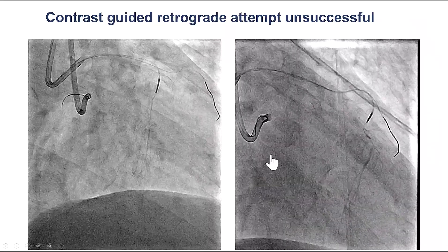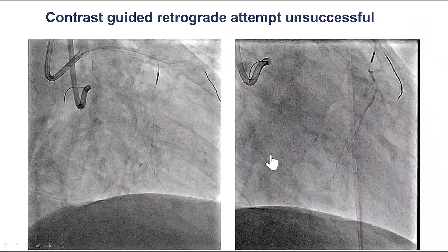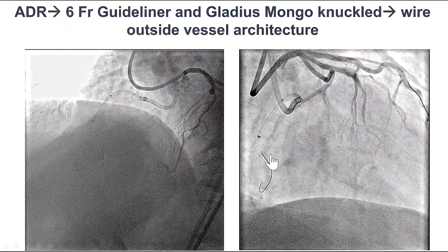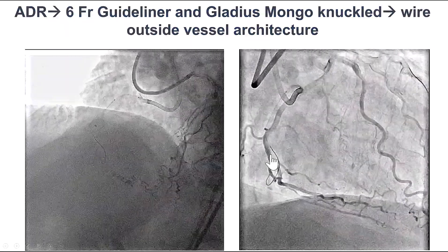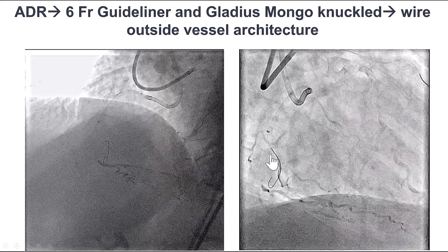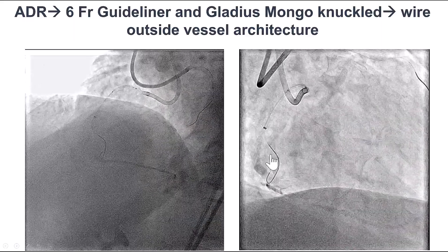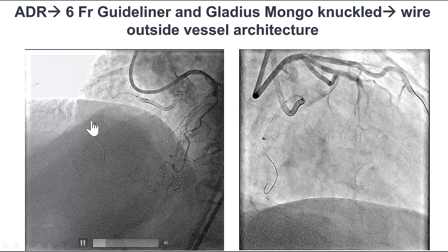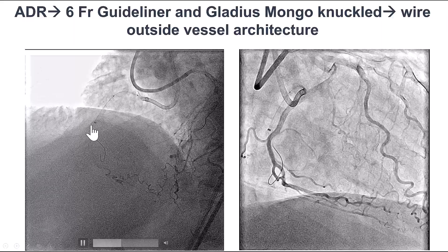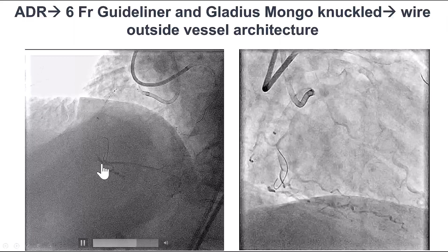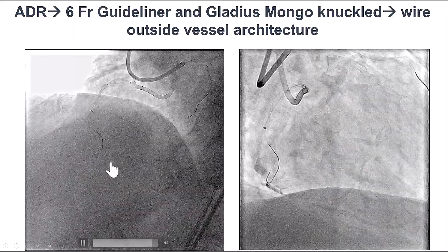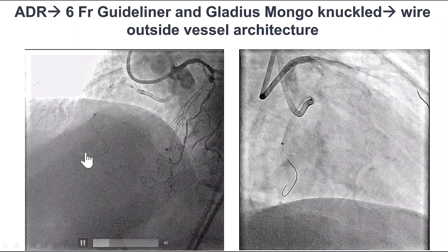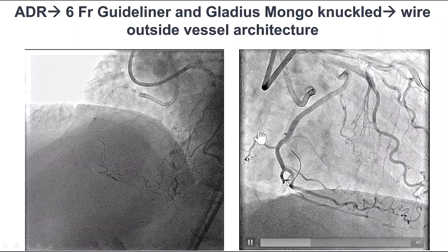After multiple attempts, the decision was to go back to antegrade and do ADR. We used a guide extension that provided a little more support, and then we knuckled a Gladius Mongo guidewire, which however seemed to go in an unusual course — more along the side of an acute marginal instead of going down the RCA.